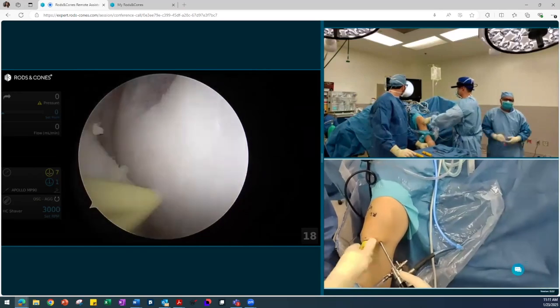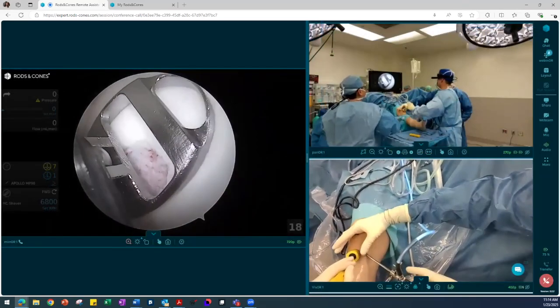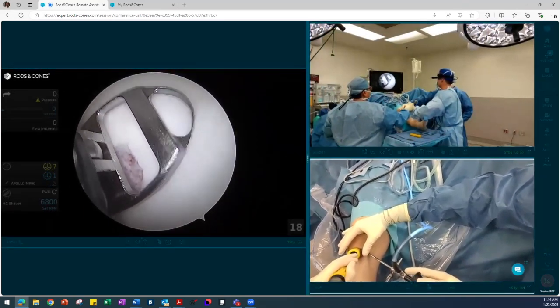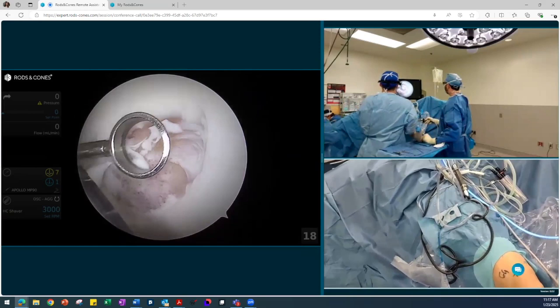We're going to insert the MACI Arthro cannula. This is a 15 millimeter cannula. You want to make sure you go beyond the black tip of the cannula, and then we're going to use this, the smallest cutter option. We're going to mount this down gently, and then once we get the outline, we're going to slowly use the curettes to prepare the defect.